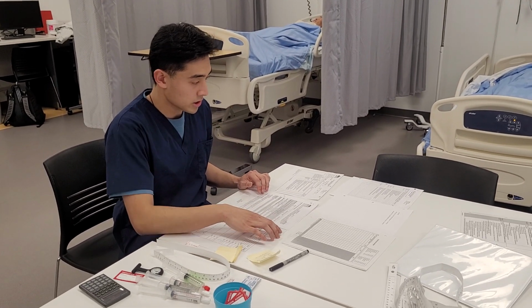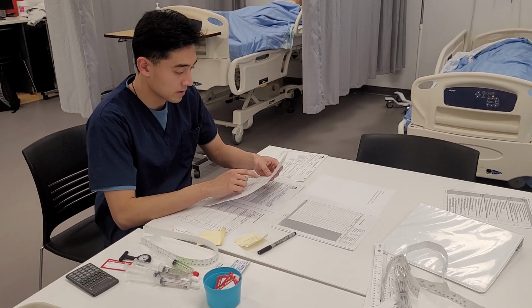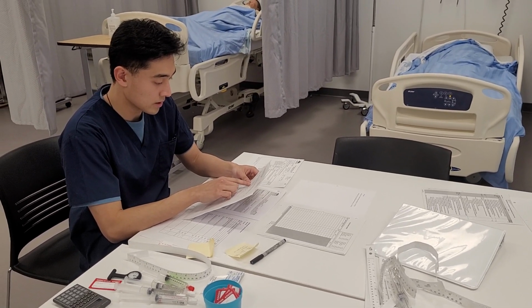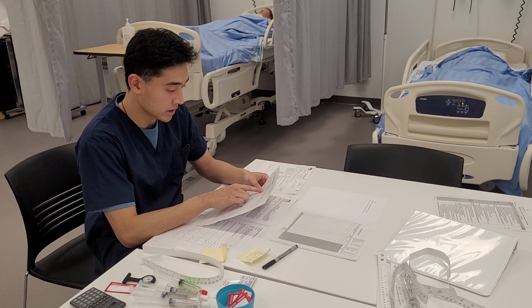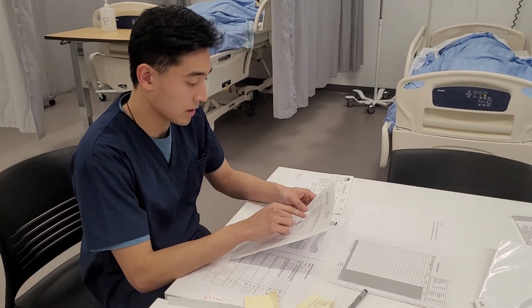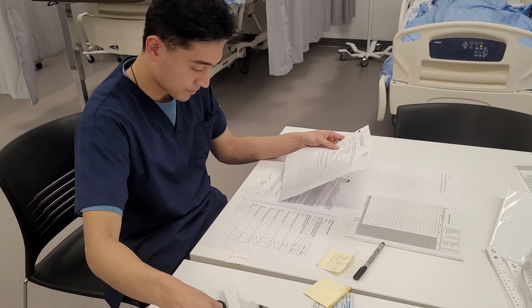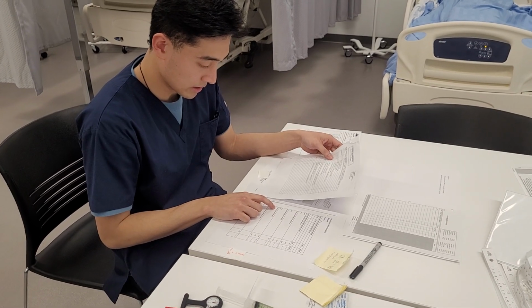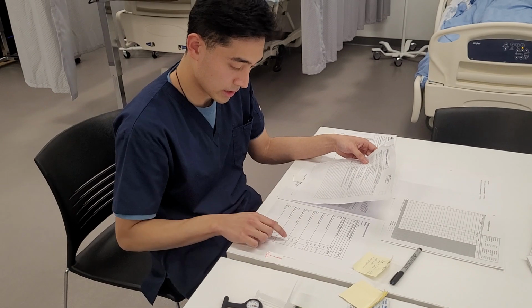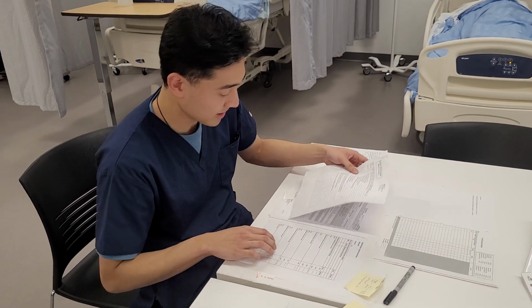So I'm just going to check the doctor's orders over here, to see what kind of antibiotic they're getting. The doctor has ordered Cefazolin, 1 gram through an IV every 8 hours. So I'm just going to compare that to the MAR. Cefazolin 1 gram IV every 8 hours, and I'm going to give this 600. Okay.